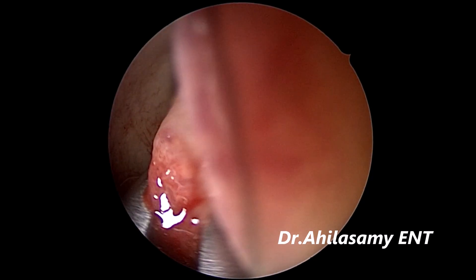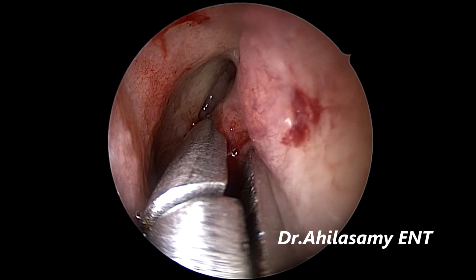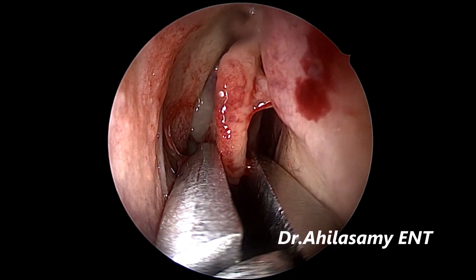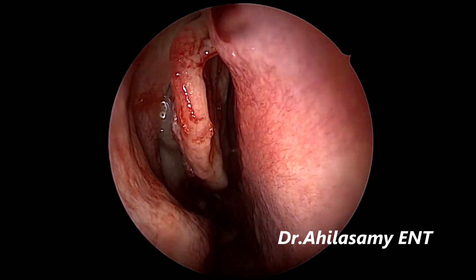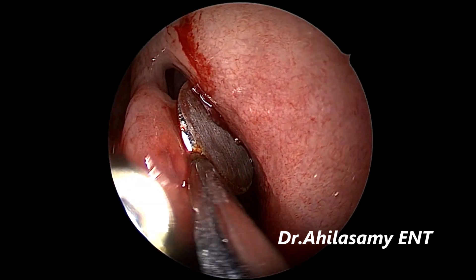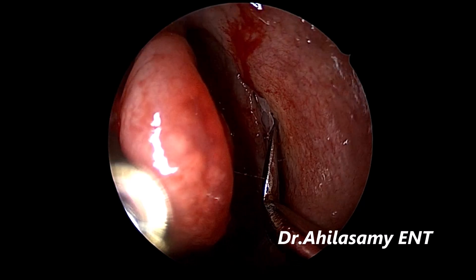To make it into a very thin middle turbinate, so that you can appreciate the middle meatus on both sides after crushing. You can even see the bulla also. Very thin middle turbinate. We are not losing mucosa or any bleeding or raw areas. Now I am using my own design, Dr. Ahila's Uncinate Dissector, to take out the uncinate on the left side.